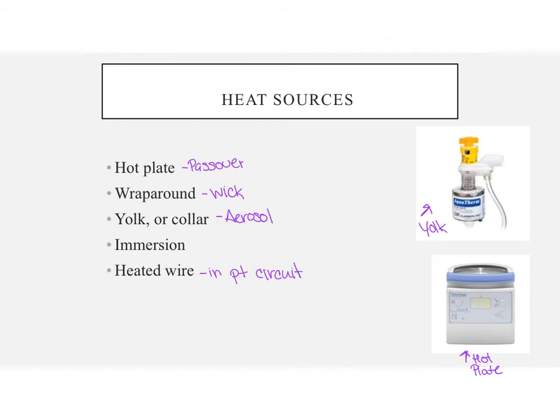There are two types of system. The first system is a simple system, in that the controller or the base is going to monitor the heating element itself. And then you have the servo controlled, and that's going to be a bigger system, and that's going to monitor temperature at or near the patient's airway using a probe.